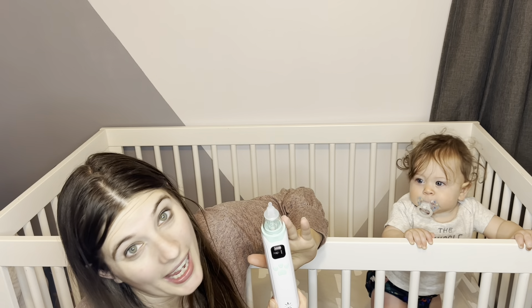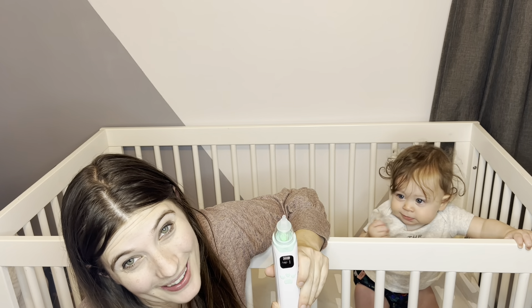We know that you and your little one will find this nasal aspirator to be such a help when it comes to stuffy and runny noses.